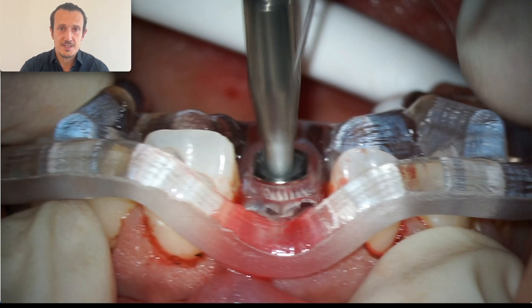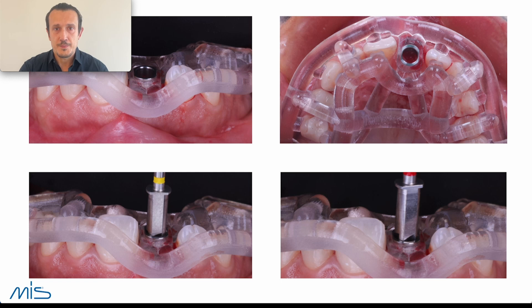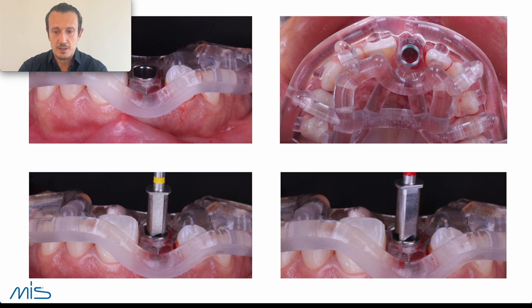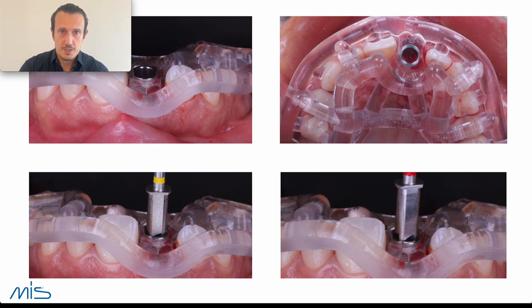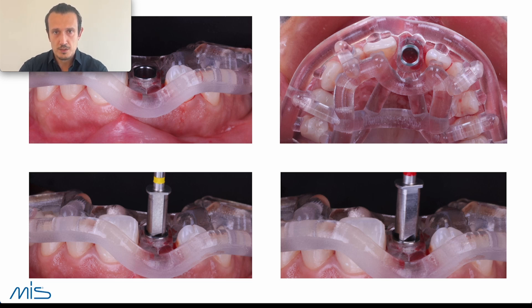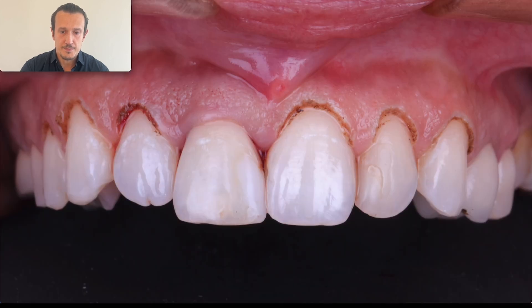This is the protocol for the M-guide: the M-guide in place, then the yellow and red burrs and drills. The main point here is that with the last drill I don't go all the way to the end in order to achieve optimal primary stability.